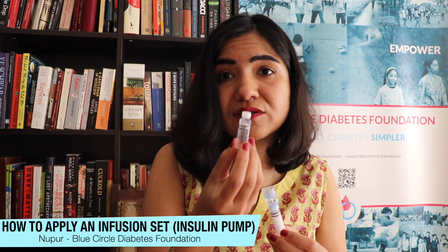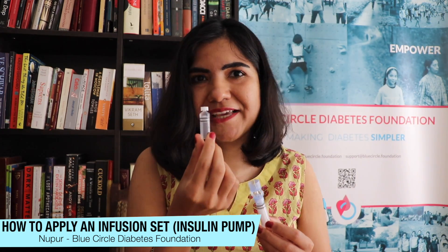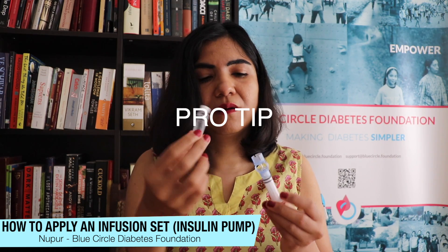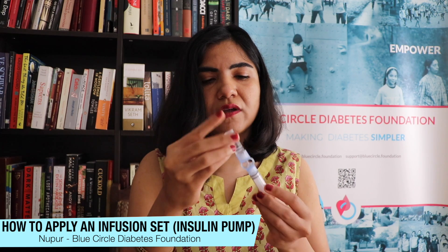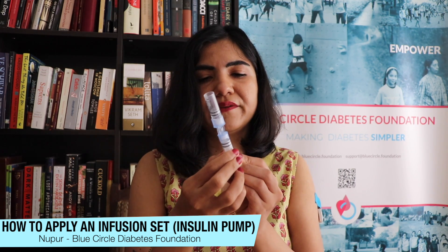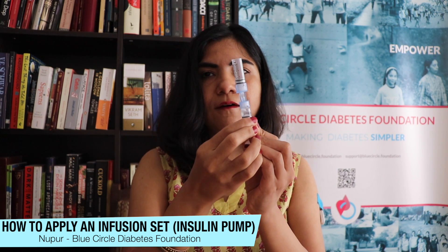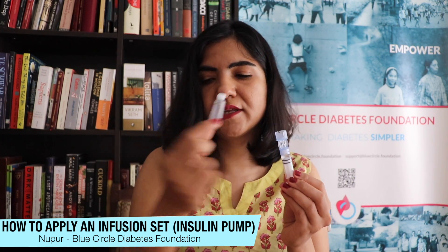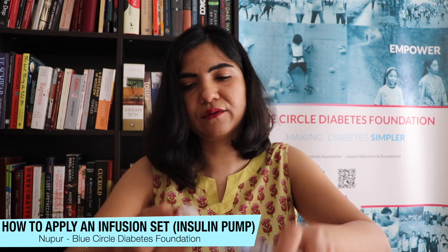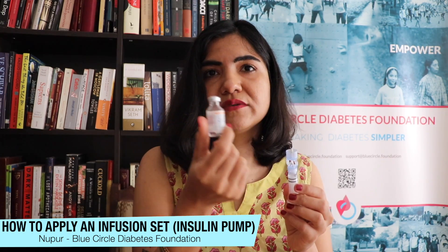I already have some insulin in my previous reservoir that I don't want to waste — insulin is incredibly expensive — so I'm going to use that. I'll pull out the existing insulin from my previous reservoir and draw it into the new reservoir. There you go — I've used every last drop. I keep that aside and now take my vial of insulin. I use NovoRapid; you can use a vial or a cartridge.